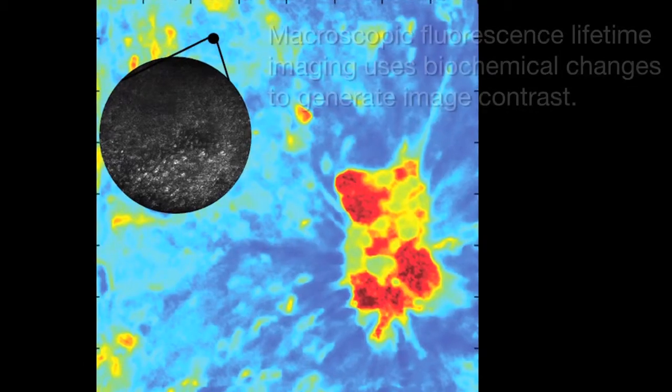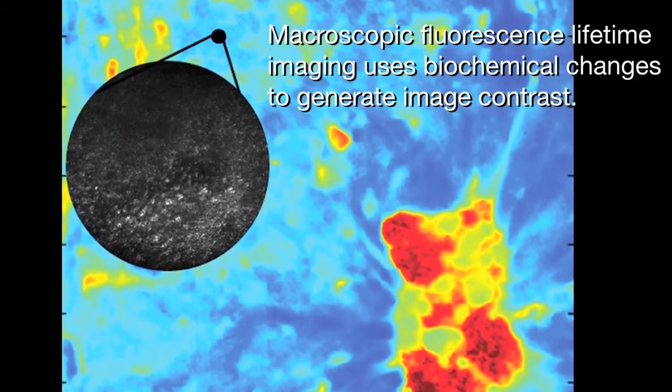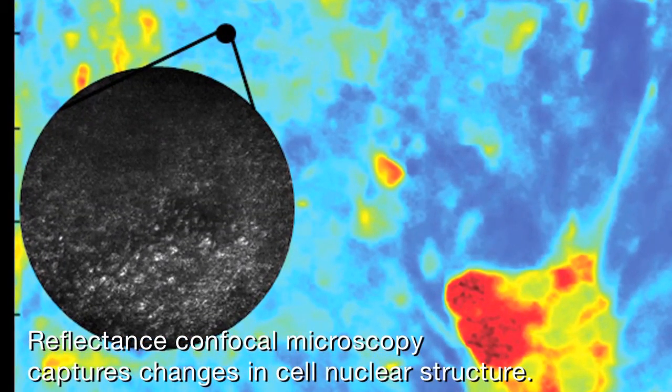And so with fluorescence lifetime imaging, we're looking on a macroscopic scale to look over an area of lesions that might have multiple lesions and looking for this biochemical signal from the lesions that give us a high-risk area.